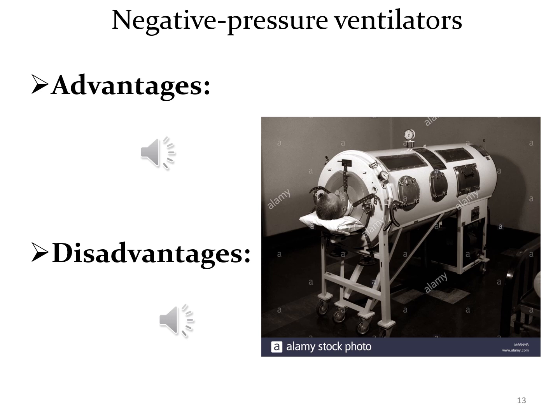Disadvantages. The negative pressure generated was applied to the chest as well as the abdominal wall, thus creating a venous blood pool in the abdomen and reducing cardiac output. The negative pressure ventilator is by necessity large, limits access to the patient for therapy, and leads to patient discomfort.